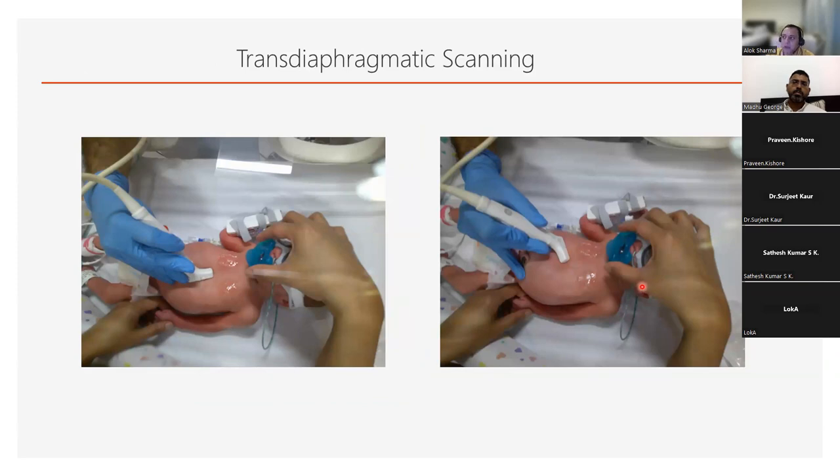Now, in terms of the fourth view, recent classifications have talked about basically doing infra or subdiaphragmatic, transdiaphragmatic scanning. And the idea is to obtain that, really what you want to do is you want to keep the situs view that you'd normally keep for your echocardiography, and then put your probe under the rib spaces. Now, this is the one that is incorrect, because really what you want to do is you want to keep this probe towards the right shoulder. So we need to turn this around.